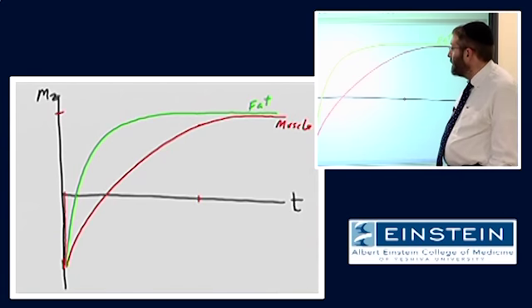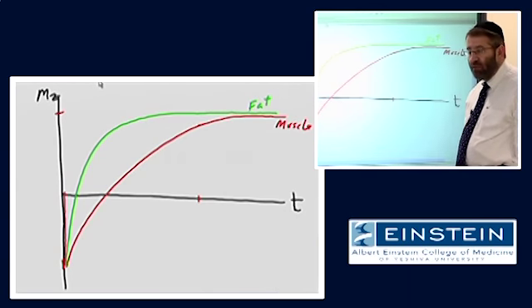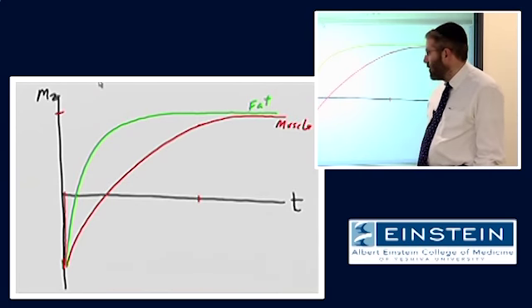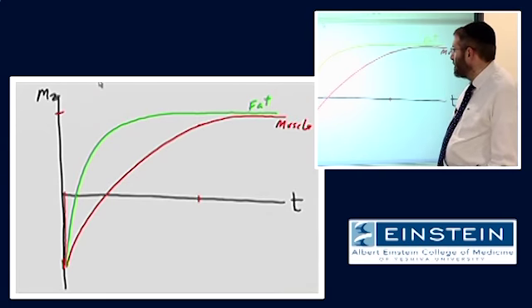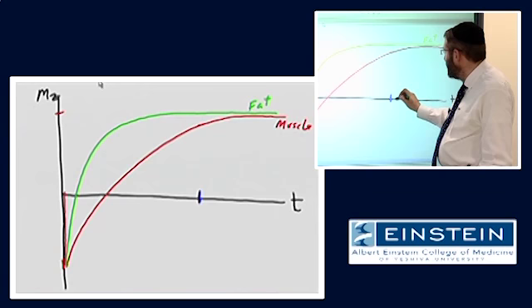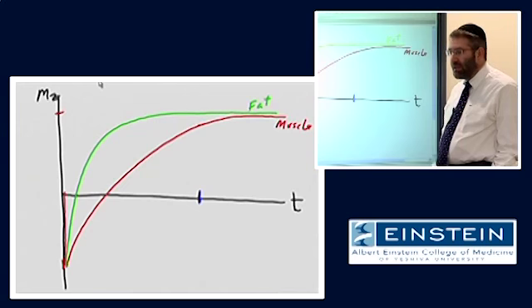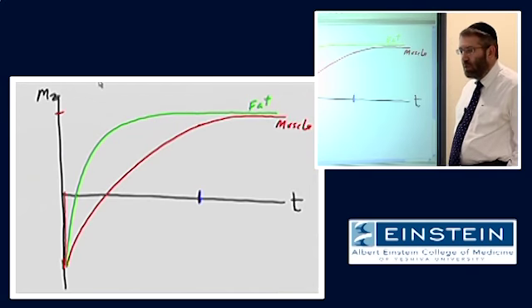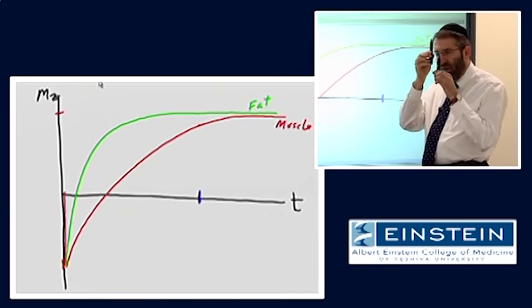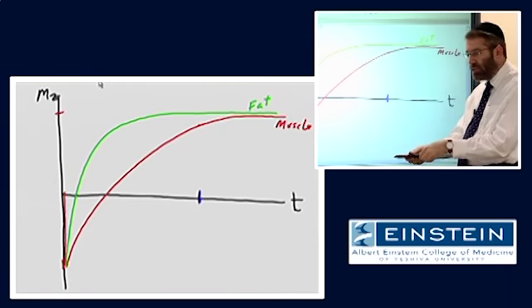Well, if we then start out by giving our 90-degree, our 180-degree RF pulse, the next thing we have to decide is where are we going to place our 90-degree RF pulse. If we place it over here, where we started out before, there is a very similar amount of longitudinal magnetization from both fat and muscle. When we generate that signal, they will have similar longitudinal magnetization, generate similar amounts of transverse magnetization.